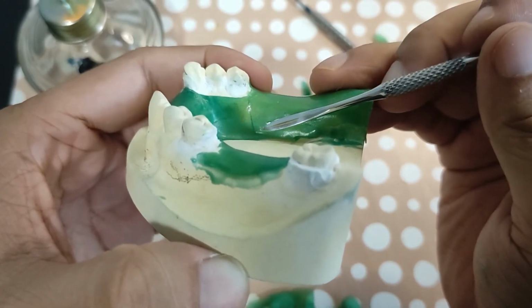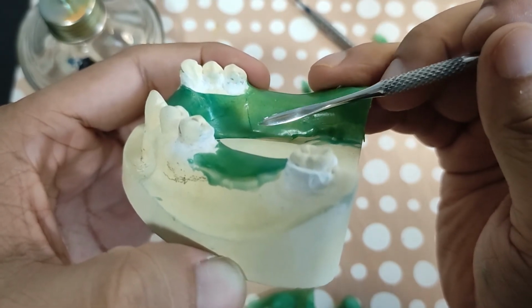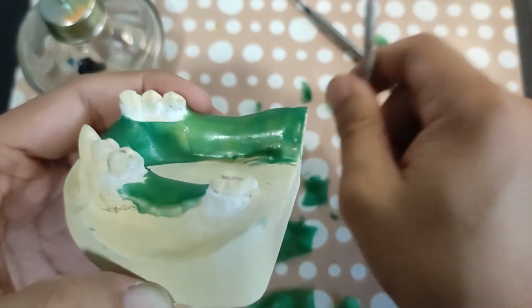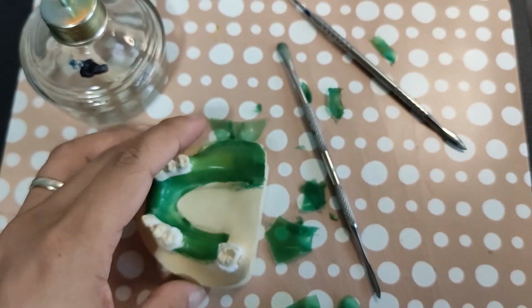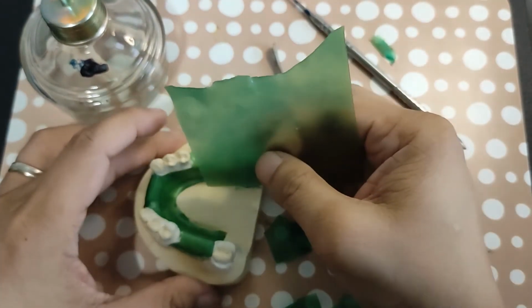So if you're going to put the secondary layer, the second layer of your sheet wax, we're going to move it maybe about 1 millimeter away from that line. Okay. So this is the second layer.